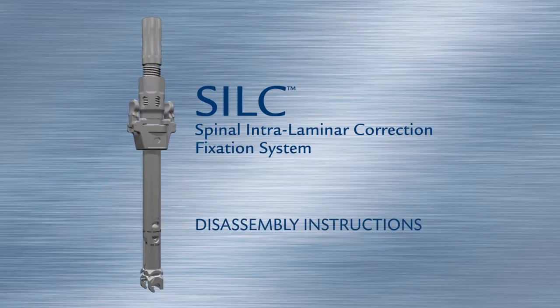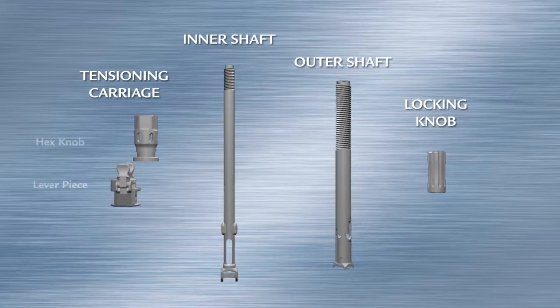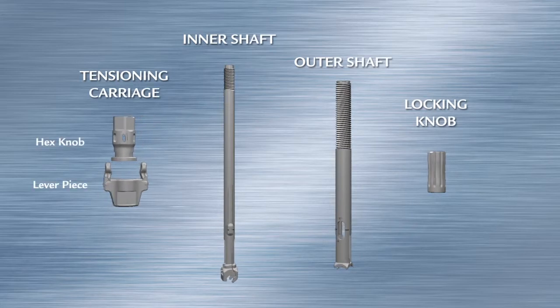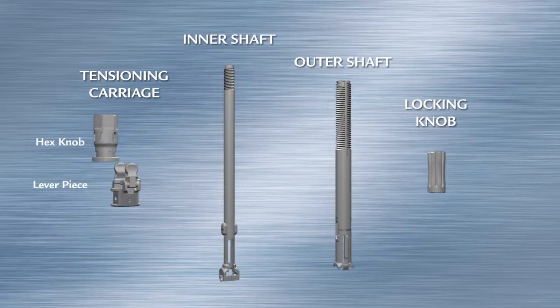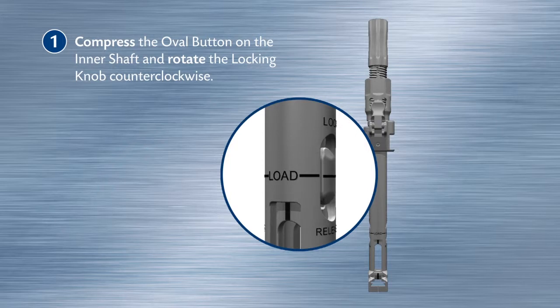SILK Spinal Intralaminar Correction Fixation System disassembly instructions. The SILK tensioner is comprised of five key pieces: the tensioning carriage, the inner shaft, the outer shaft, the locking knob. Press the oval button on the inner shaft and rotate the locking knob counterclockwise.